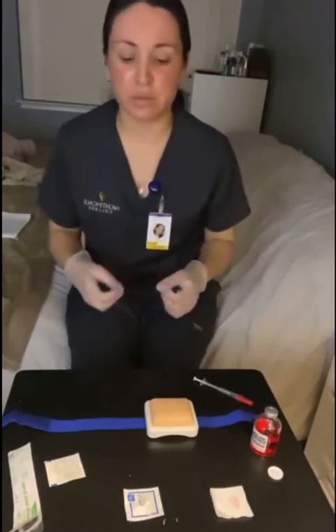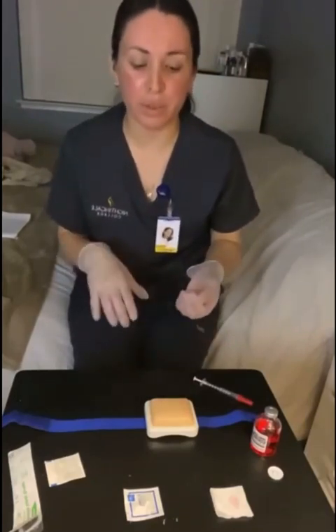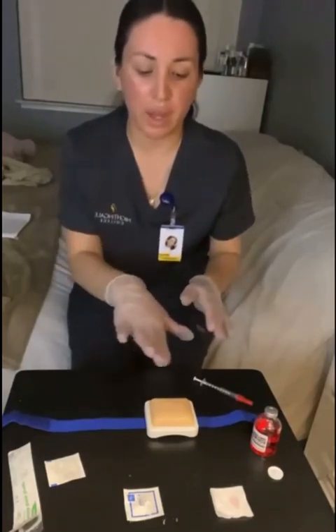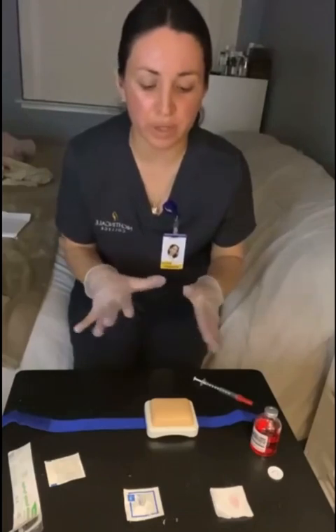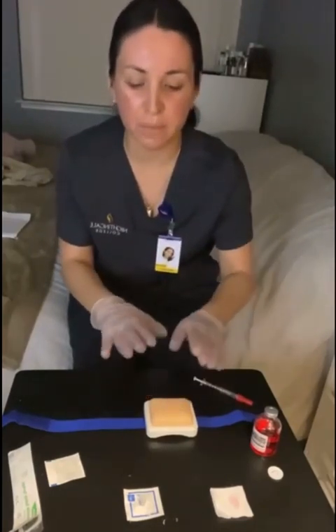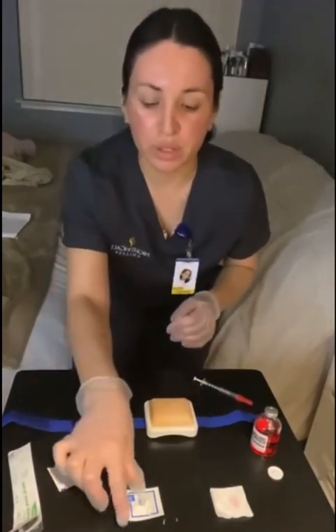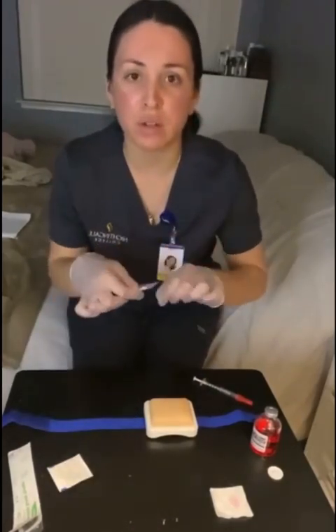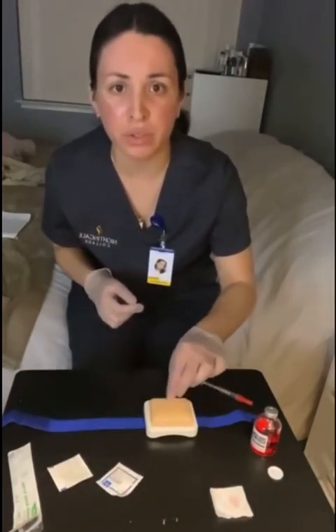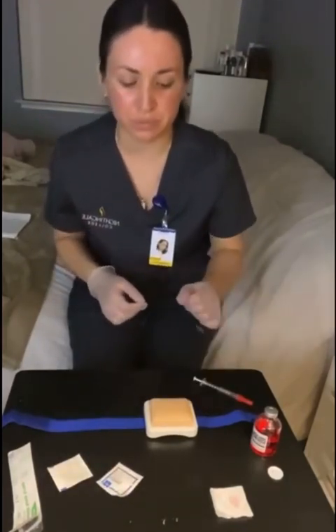Next, I would find the appropriate site. I'm going to use one hand width from their wrist, and if it's contraindicated, I would use a different site. At this point, I don't see any lesions or discoloration. I'm going to tap for tenderness. We're okay. We're going to use an alcohol swab. I'm going to take the alcohol swab out. I'm going to start from the center and clean outward about 2 inches.